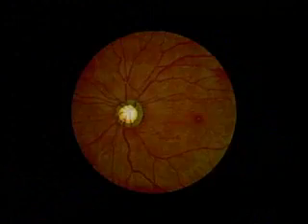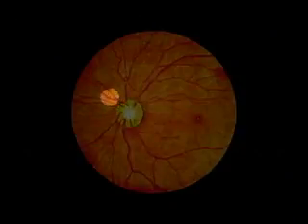Moving your head and instrument as a unit, inspect the retinal vessels and adjacent retina by following the vessels from the disc to the periphery in four directions. Note the relative size and color of the smaller, lighter arteries and the larger, darker veins. Look for changes such as nicking of the veins at arteriovenous crossings. There should be none.